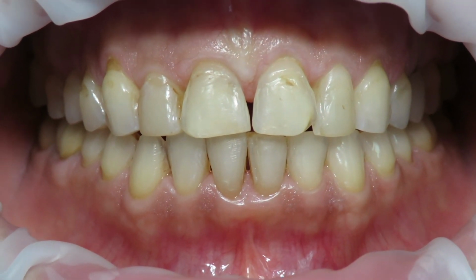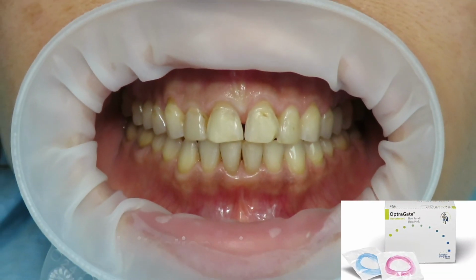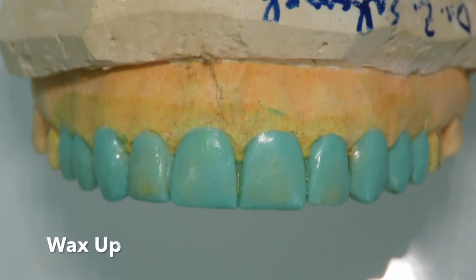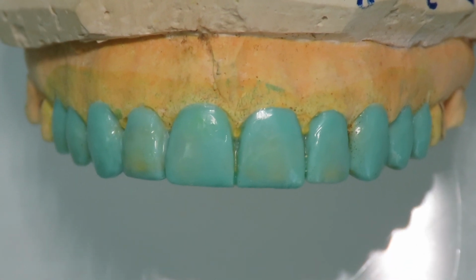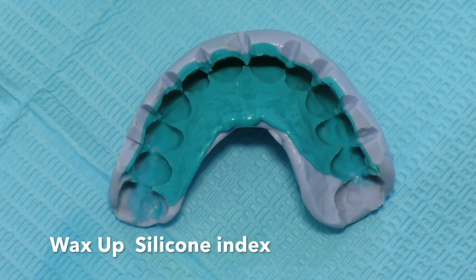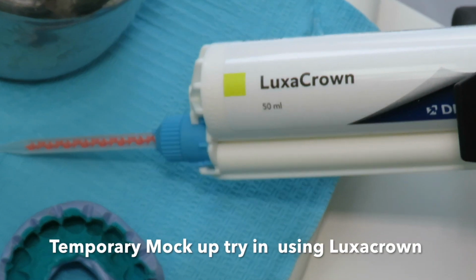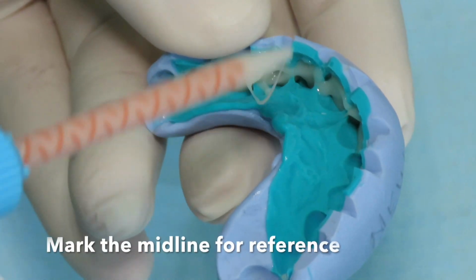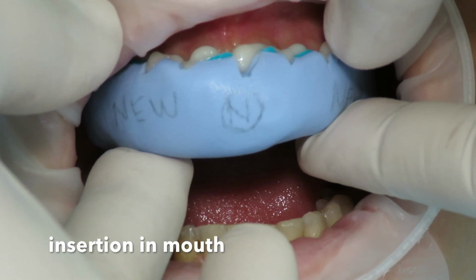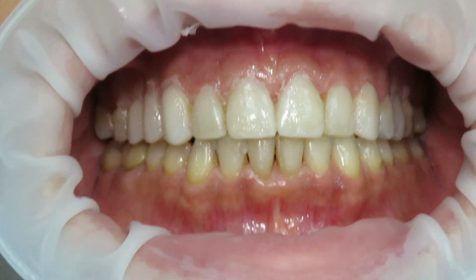So the clinical situation here is always we use Optragate because we have a very good opening, and this is a good display. A wax-up, of course, was done at the lab. Then a silicone key was taken, and this is in preparation for doing the mock-up. We use this type of BIS-GMA, which is Luxa Crown, a composite type of material that we use for the mock-up. So this is the situation after removal of the silicone index.